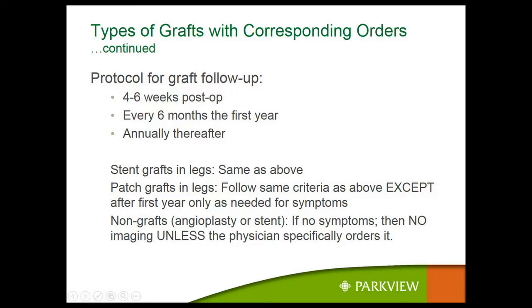The protocol for follow-up grafts, and usually the surgeon's office, or now, who else orders these? The floor nurses are going to be ordering these? Well, no, probably the extender will still get those. The extender will? Yeah. Okay. So in the prep recovery area, they are calling. Okay. 4 to 6 weeks post-op, every 6 months the first year, and then annually thereafter.